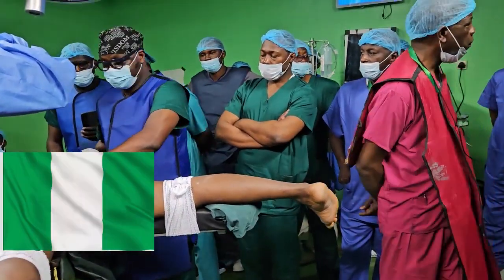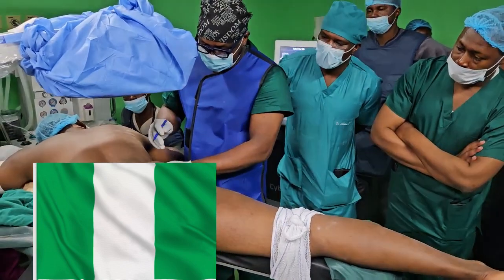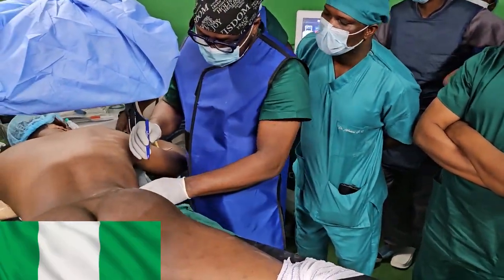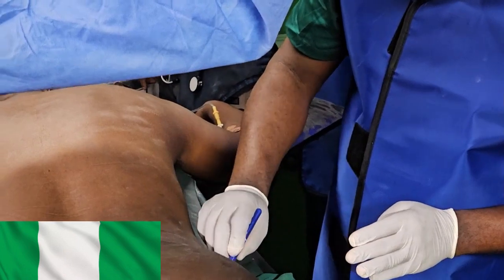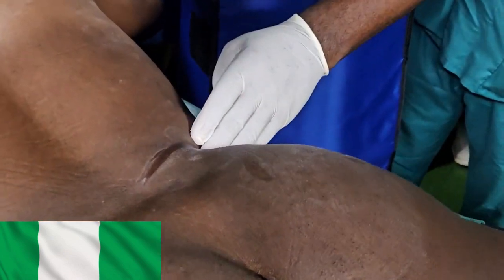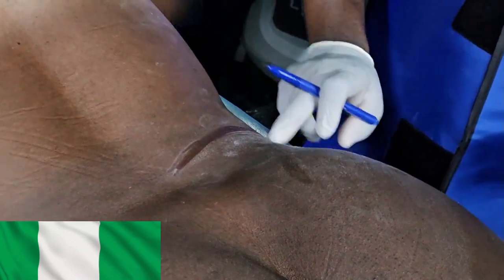the iliac crest. Okay, this is the iliac crest. That's where your pen comes in. You draw the iliac crest, the 12th rib, the 11th rib. This one is in relation to which of the ribs? It's the 12th rib. It's in relation to the 12th rib. So that's one of the important markers. Surface marking. What did you just mark? The iliac crest.